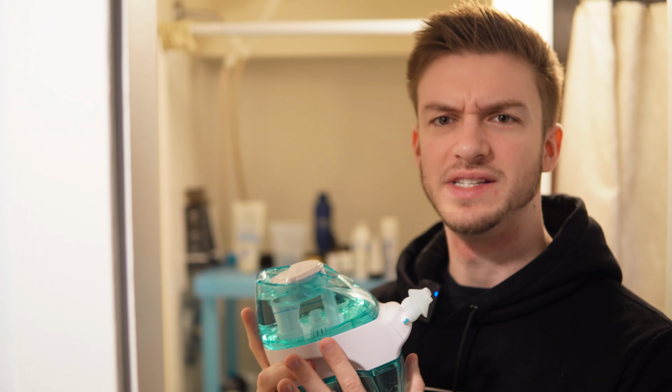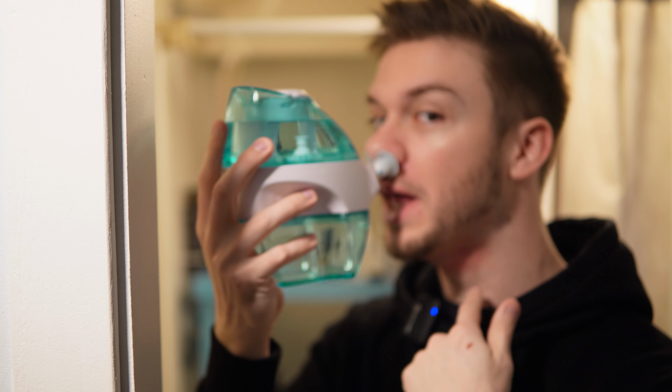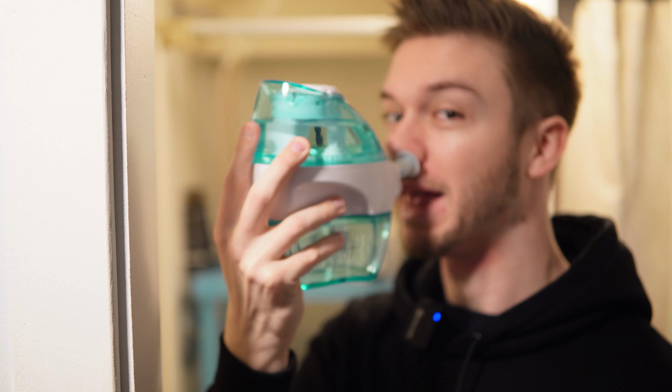Just common sanitary practices. And simply, we're just going to go here. You kind of have to close the back of your throat. It's a weird feeling, but you'll know what I mean whenever you do it yourself. I typically leave my mouth wide open, and you can kind of talk throughout it, so we'll see how this goes. Just going to shove it in there, then close the back of your throat, and you can press it.